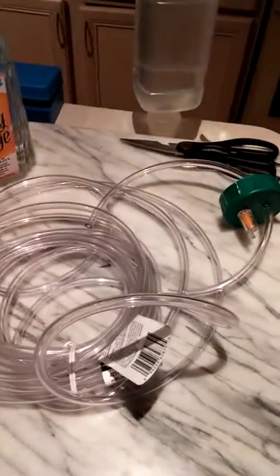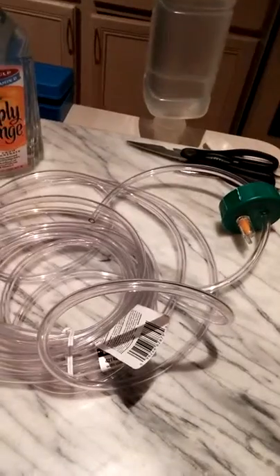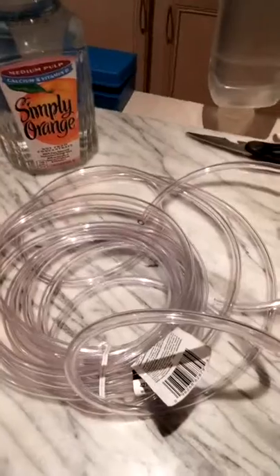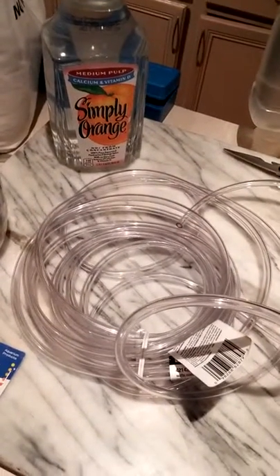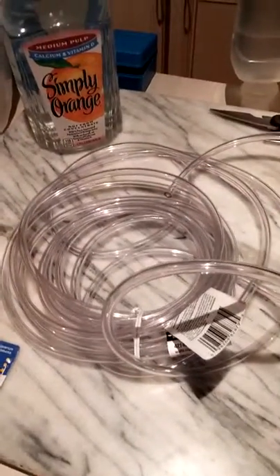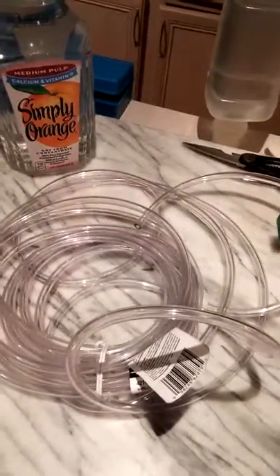If you have old tubing laying around, now is not the time to repurpose it — everything needs to be as clean as possible. These cultures don't want to be fighting bacteria on your equipment. The directions on the Florida Aqua Farms petri dish say to use sterile water and be as clean as possible so you don't contaminate the culture. For the first one I'm going to be very sterile, and then after I get a culture up and running I might get a little more lax.